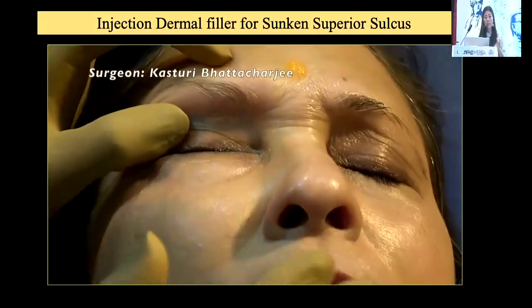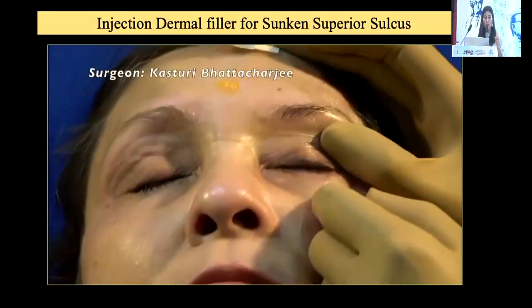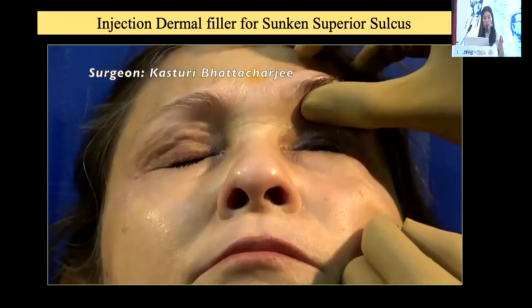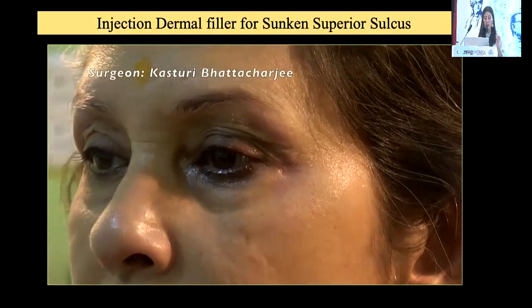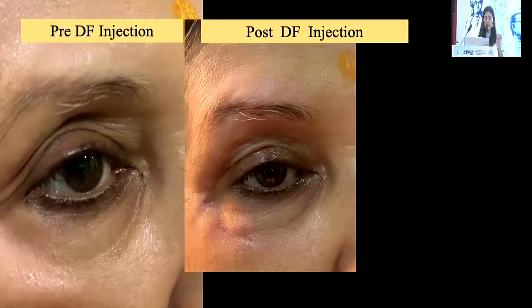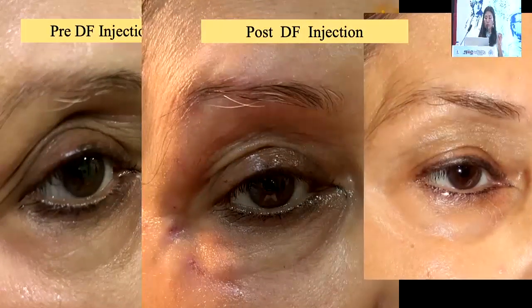And a very simple way is pre-septal, which is very safe, but you need to mold the product very well. You wait for some time, give a very nice massage, and this is not a very concentrated hyaluronic acid, so it can be molded very well. And this is how she changes on the table. This is just before the dermal filler injection. This is the next picture you are seeing. This is just after the injection, and then you see the beautiful result.